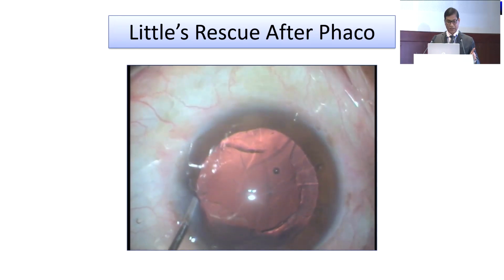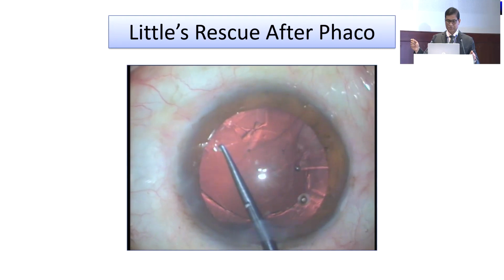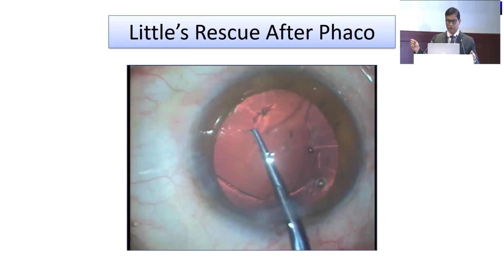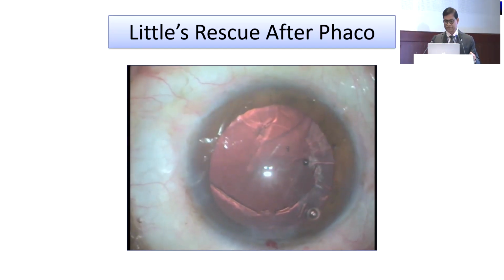Create that nick, and I'm not going to use my shearing forces. I'm going to use stretch. See that? And I'm going to do that, and there. I included that radial stretch that was there. So that's about all. Thank you very much for your attention.